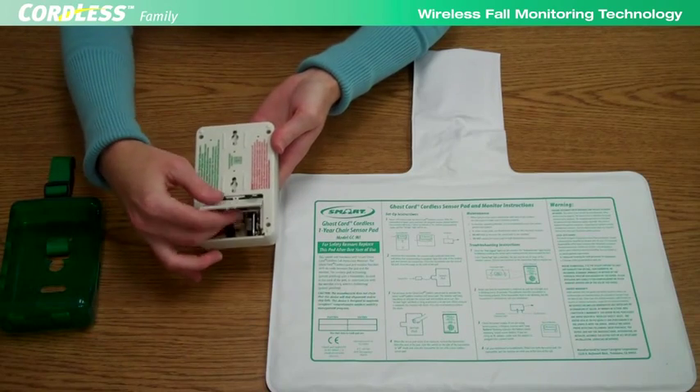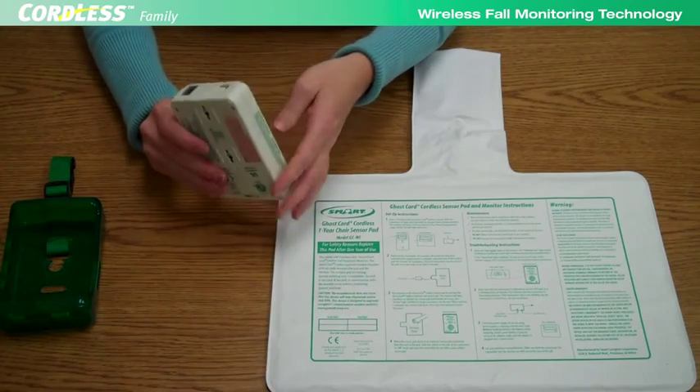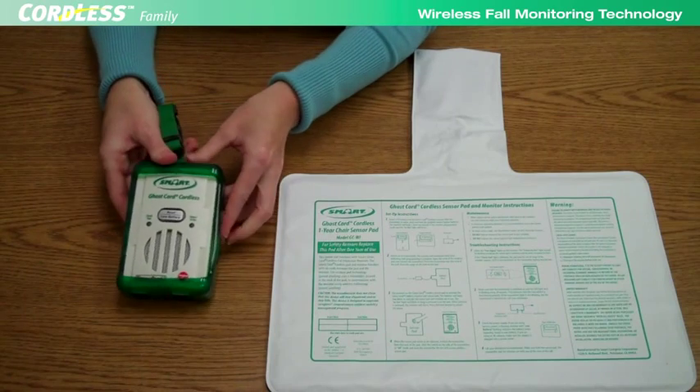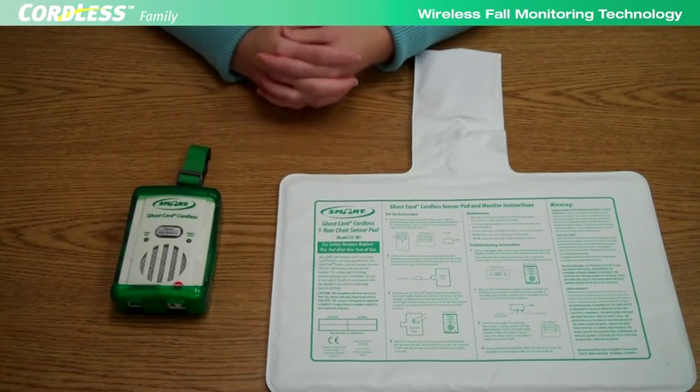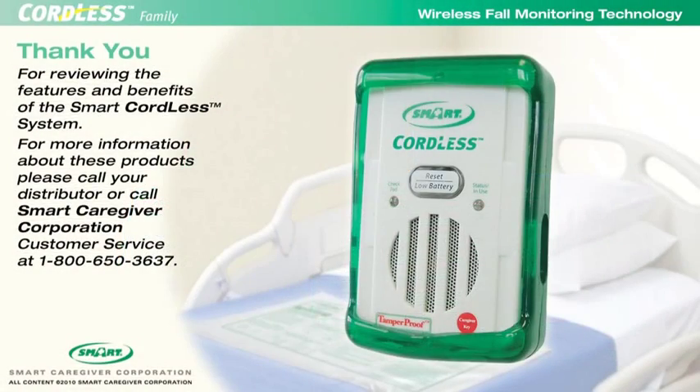The battery door may be secured with the included screw. Replace the protective boot. The system is ready for use. Thank you for reviewing the features and benefits of the Smart Cordless System. For more information about these products, please call your distributor or Smart Caregiver Corporation at 1-800-650-3637.